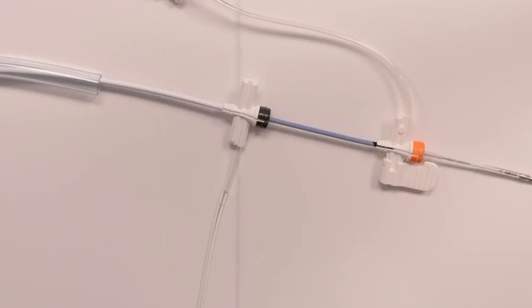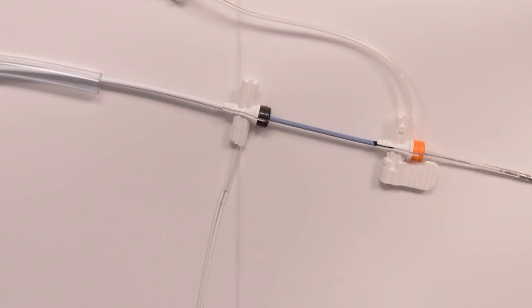In this system, we only have one type of material to cut through instead of the hub, so we're basically going to break the hub. We notice the little V-notch there that's very handy for the slicing tool to engage.